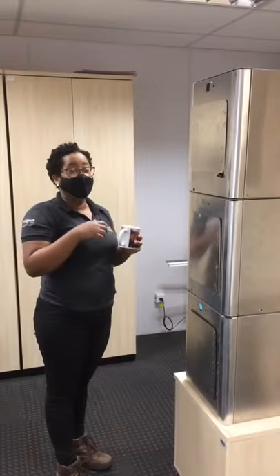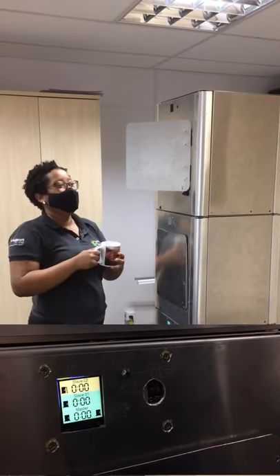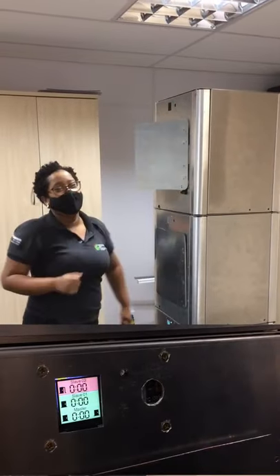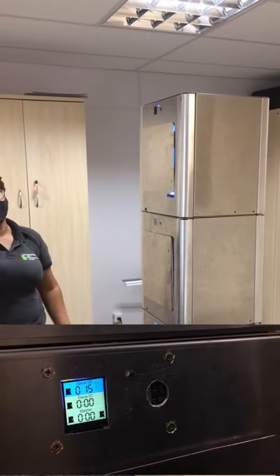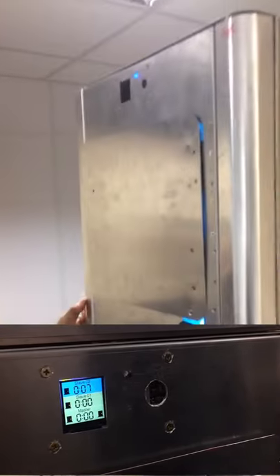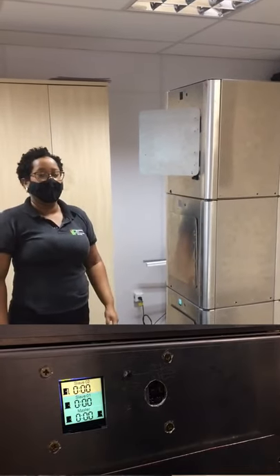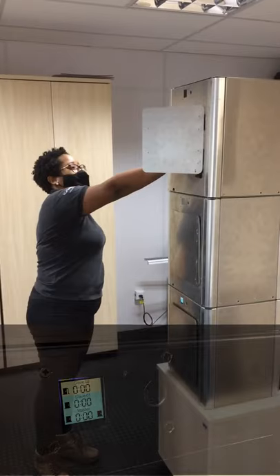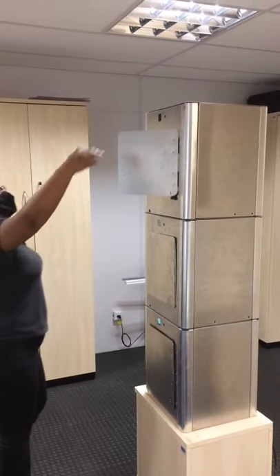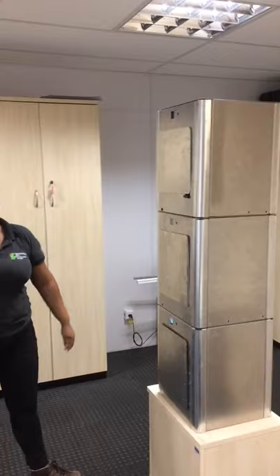Agora vamos fazer a demonstração do funcionamento do módulo escravo 2. Vamos fazer o gesto para a direita para a abertura da porta. Usar uma caneca de exemplo. E o gesto para a esquerda para o fechamento da porta. A gente pode ver que a luz UV foi acionada. Ele está com bastante fuga de luz, porque esse é o módulo que vai ficar aqui no polo de inovação com a porta menor. A gente também vai fazer os ajustes e colocar algumas borrachas para minimizar essa questão do vazamento da luz. Tirando a caneca já esterilizada.